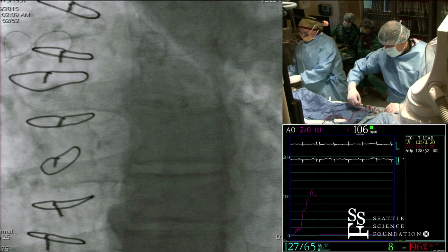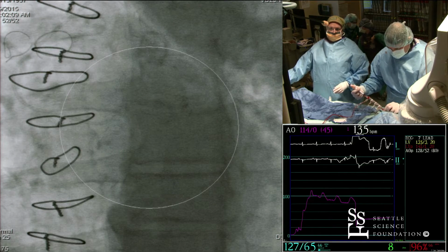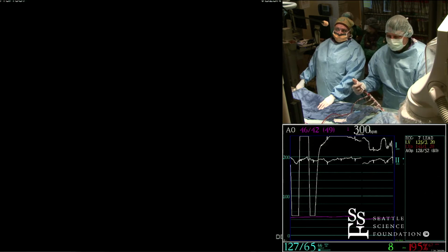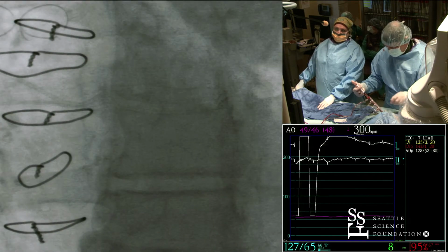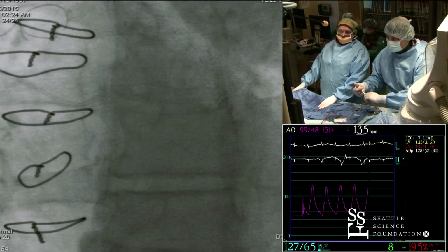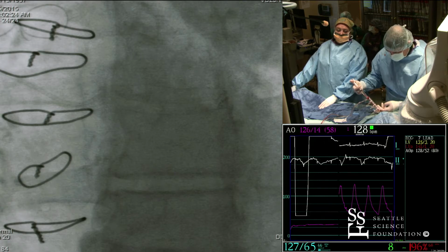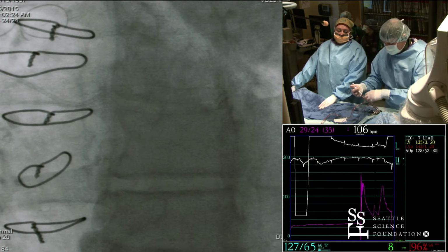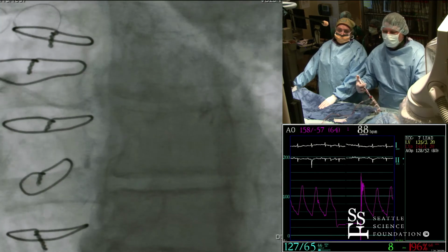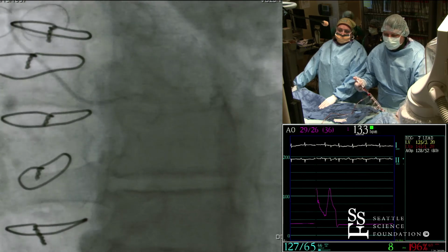Sometimes a deep breath will help. It's a little bit more of a challenge sometimes to engage, and oftentimes when you put a catheter in, it really is directed toward the superior wall of the left main. That's okay, but it means for the first injection you want to inject slowly, just to make sure you don't do a jet dissection of the artery. It's less axial than if you were coming from the leg. Okay, I just doubt that I'm in the corner right now. Yeah, it's close.